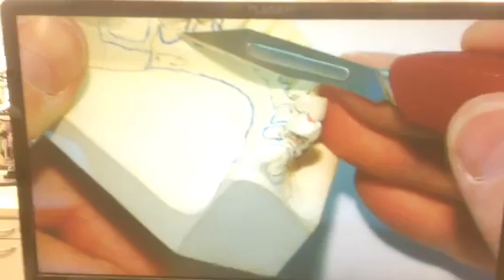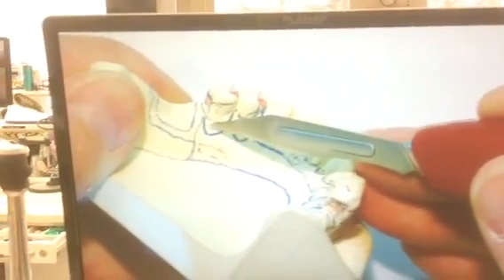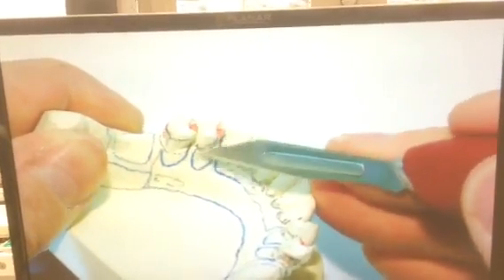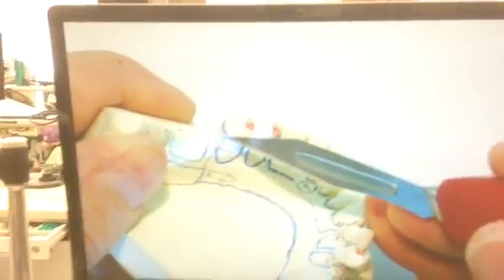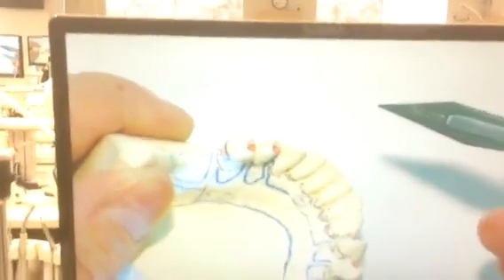I don't like these 2 windows. It really weakens the framework, pinches the tissue. Not something I would encourage doing, to drop down, come up, drop down, come back up. I would have flowed the lingual bar. I would have just come right across here and come on around into my rest, and drop down. Or come on across with the plate.